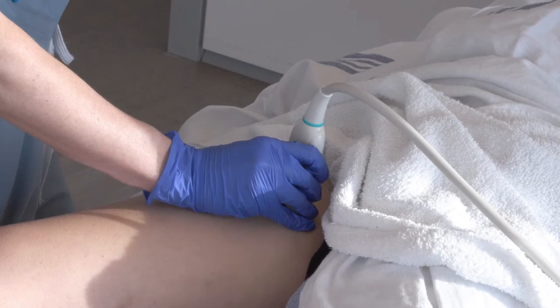When scanning, the indicator marker should be pointing to the patient's right. Essentially, all views will be obtained with the probe taking axial slices of the vessel of interest. In particular, in the femoral region, you should hold the probe like a pencil and ensure that your hand is anchored against the patient's skin for stability.